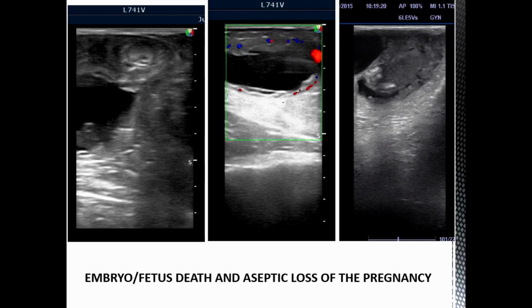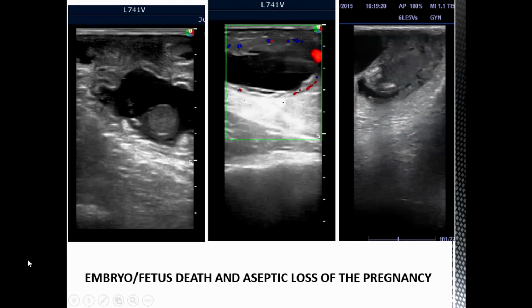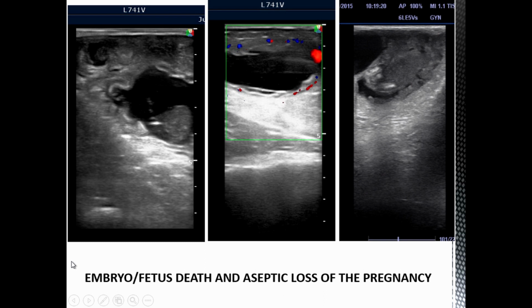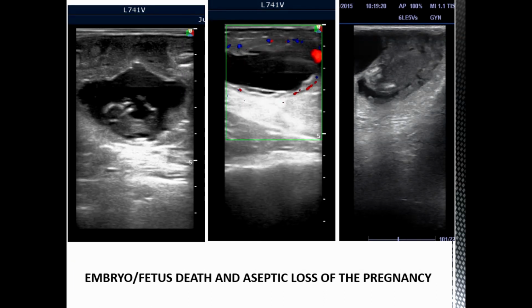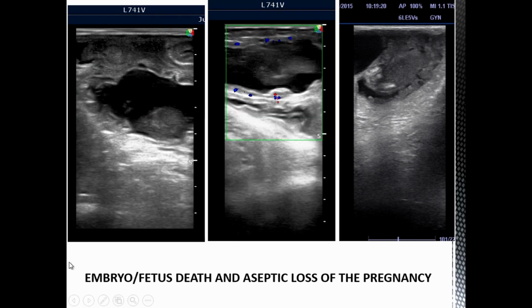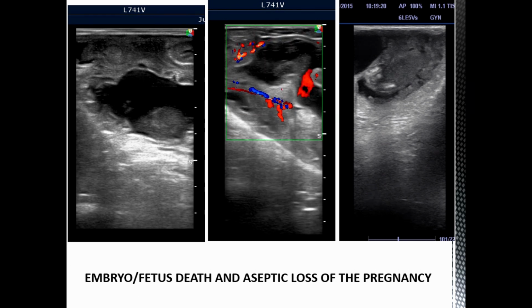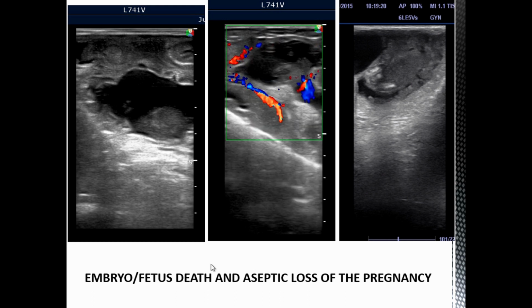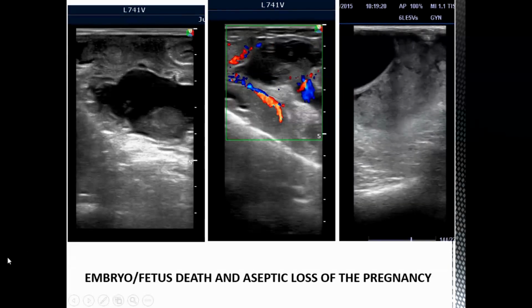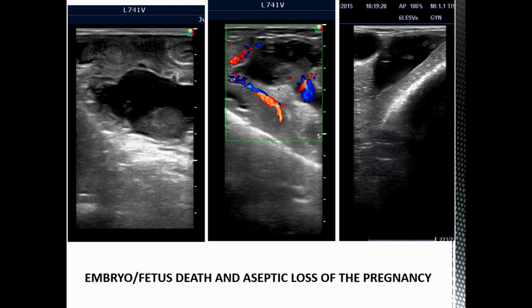Now, going to embryo loss, we have in the first video, please. In B mode, normally we can see the absence of heartbeat, so the animal's thoracic wall here, without heartbeat. And to the next one, color Doppler can be helpful too. When you see the fetus without vascularization inside, you can use these two together. And the last one, when you have the absorption of the contents in the uterus, you have this appearance, but it's important to highlight here the anechoic fluid formation without a septic involvement.